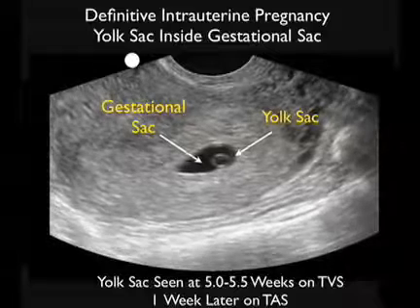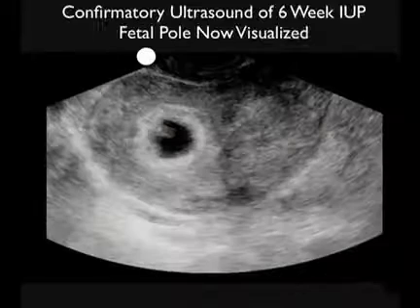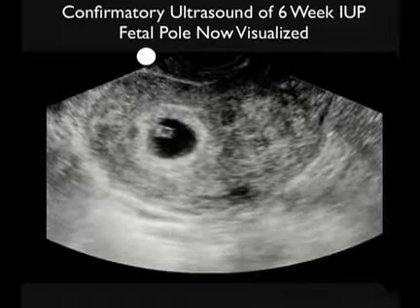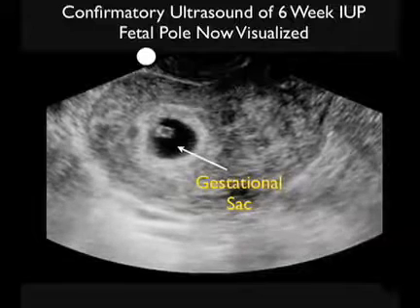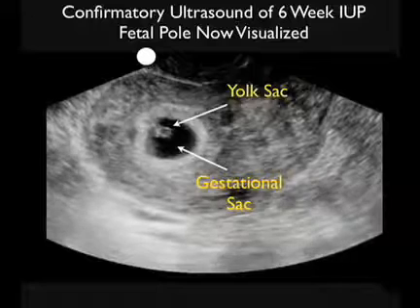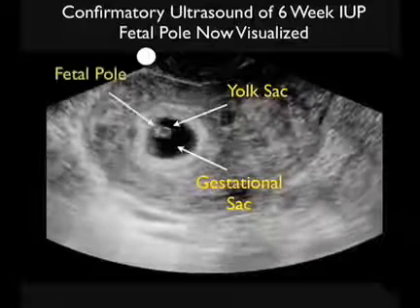And the yolk sac is generally seen at about 5 to 5.5 weeks on transvaginal sonography and a week later on transabdominal sonography. Here's a pregnancy that's a little bit more advanced, and here we see a large round gestational sac, that dark or anechoic structure, and inside the gestational sac we can see the circular yolk sac or Cheerio sign.